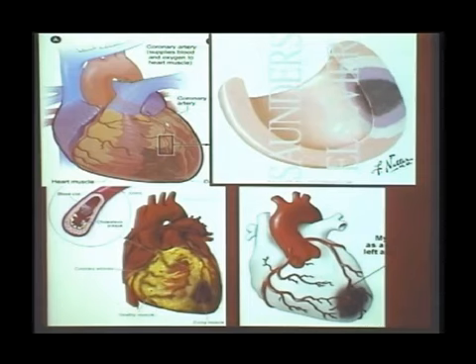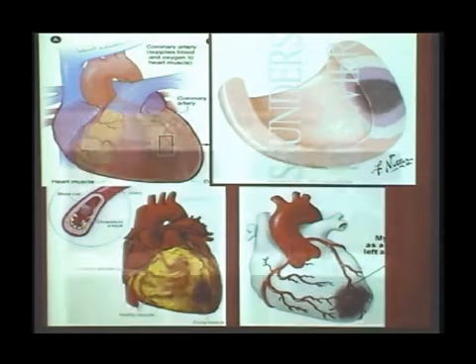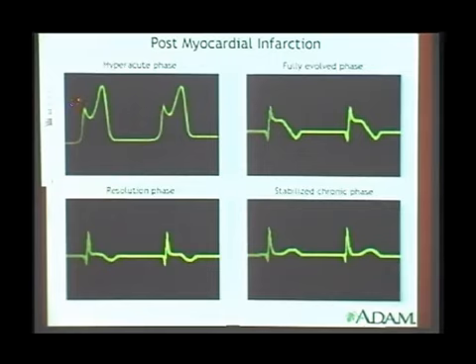So if you translate that into ECG signs, early hyperacute phase: ST elevation, three signs, slope elevation, ST elevation concavity upwards and reciprocal depression. Fully evolved acute phase: all three ECG signs, necrosis Q wave, injury ST elevation with convexity upwards, and ischemia T wave inversion. In the fully evolved subacute phase, the injury settles down, ST segment is normal, the Q wave with a T wave inversion.